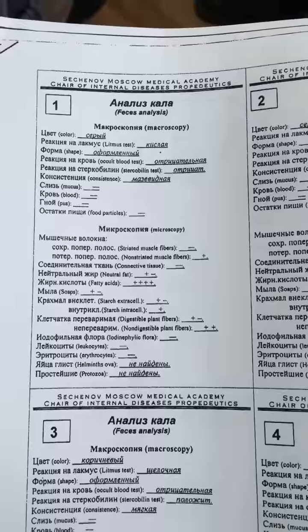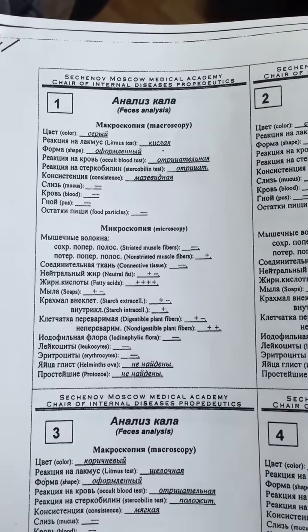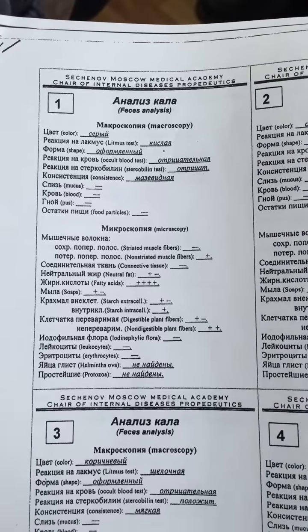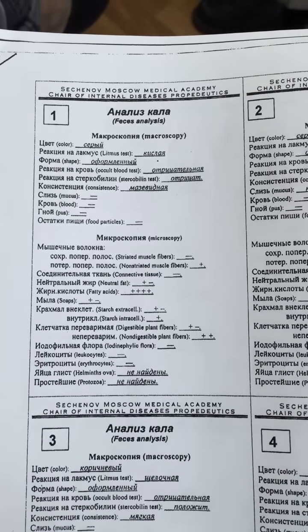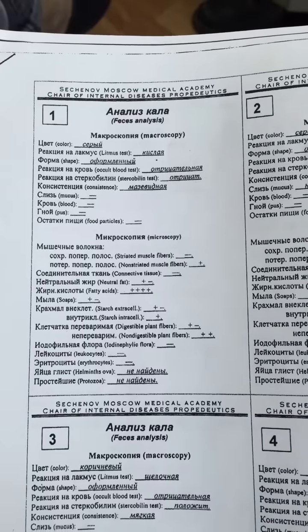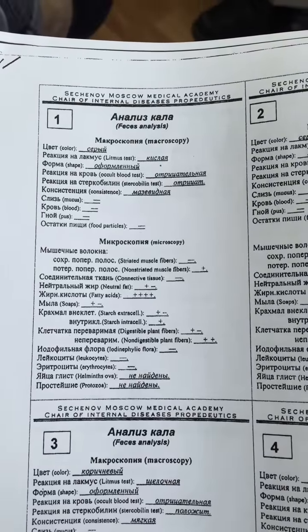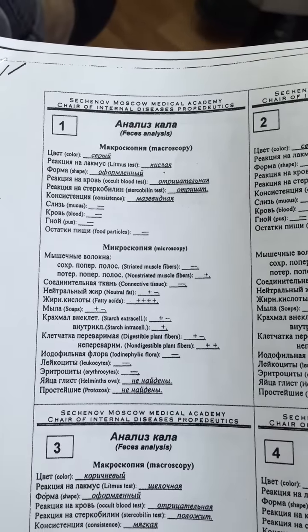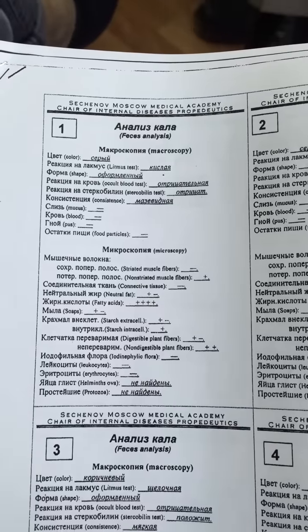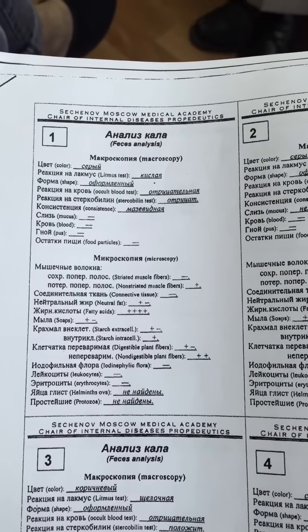First of all, the negative reaction on stercobilin. Stercobilin test is negative, and a lot of fatty acids. What does it mean? Bile obstruction, bile duct obstruction. Yes, we don't know about obstruction methods. Maybe it's a tumor of pancreas. It's obstructive jaundice. Yes, mechanical jaundice.